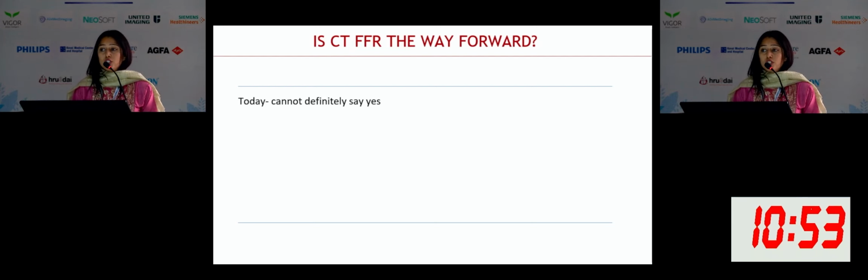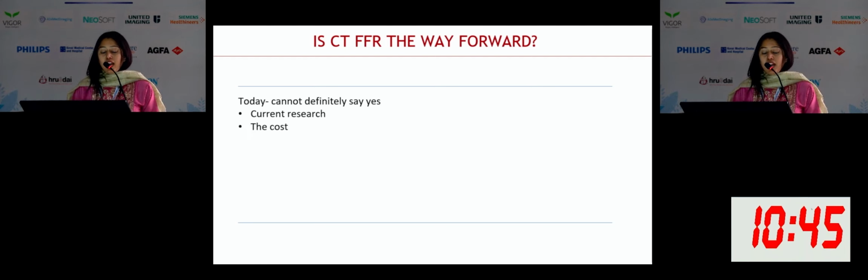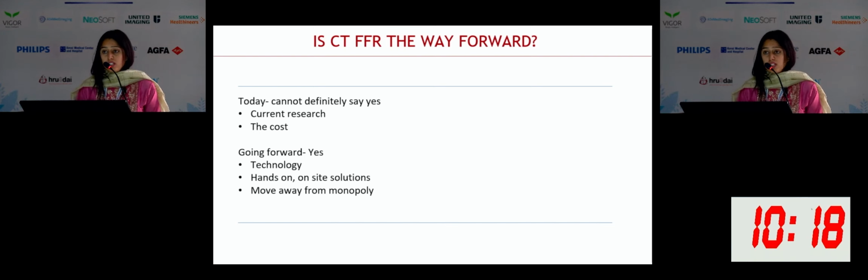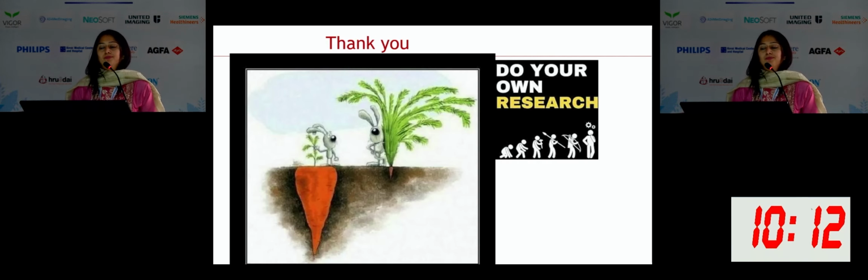If you ask this question to me today, I cannot definitely say yes, because the research is swinging both ways. And the cost, in an Indian scenario, is 70,000 rupees; perhaps a patient will get an entire treatment for that, rather than just one investigation. So it's a huge cost. Going forward, I do think yes, because we do have the technology and we need more hands-on and on-site solutions. We need to move away from one monopoly. We need to have perhaps indigenous techniques, and as radiologists or cardiologists, we need to study it. We need to know how the measurements are done and what values it is throwing up. Thank you.